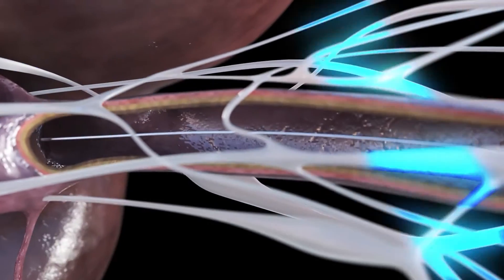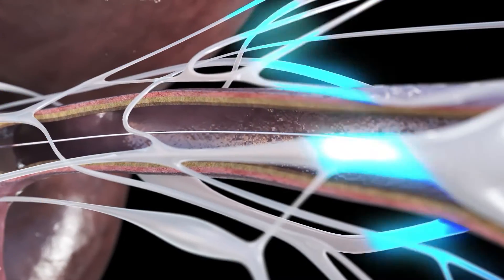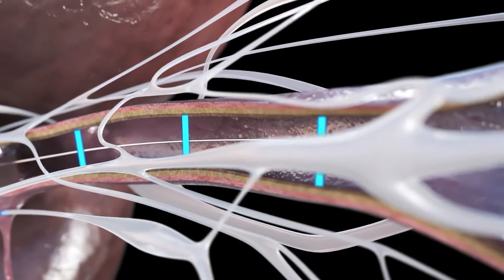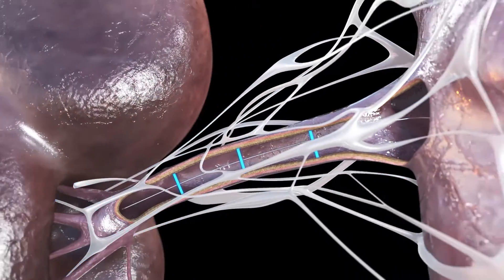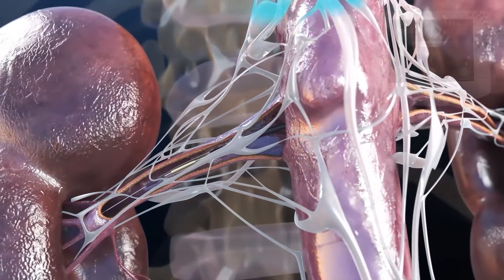Treatment in the distal branches is not necessary with the Paradise Ultrasound RDN system. Using renal angiography, the distal, mid, and proximal main artery diameters are measured to determine the appropriate Paradise catheter balloon size.